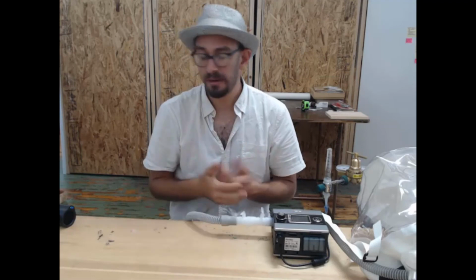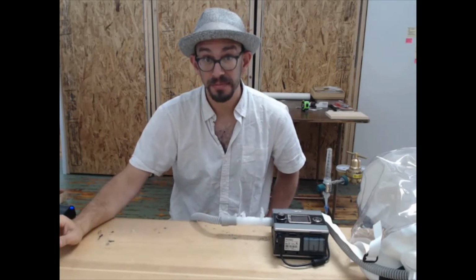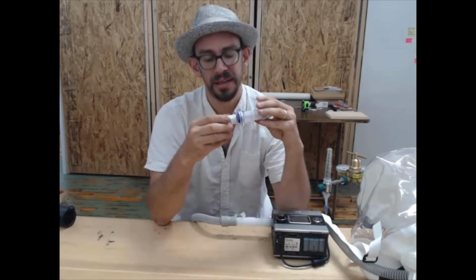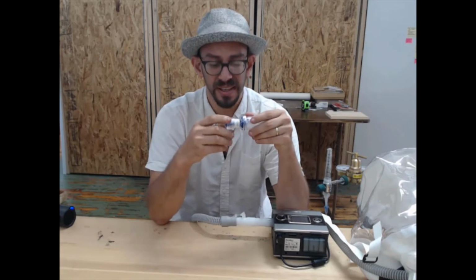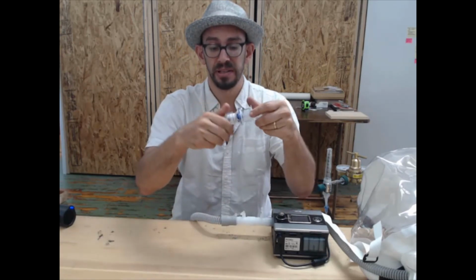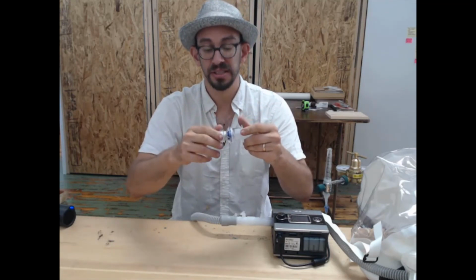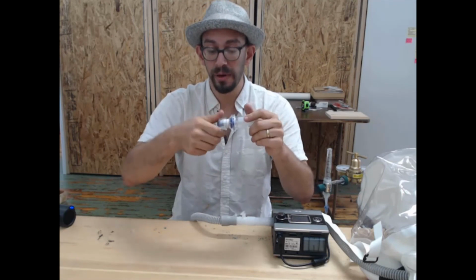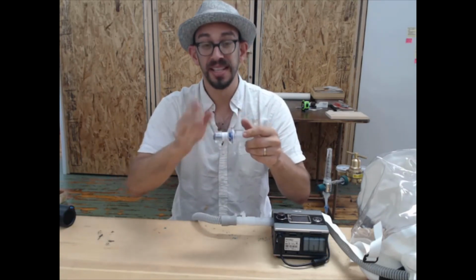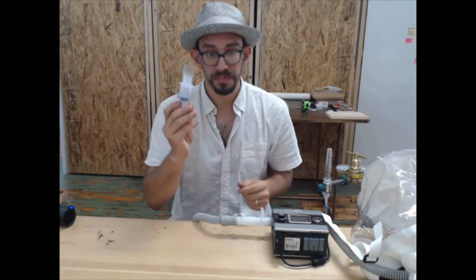Now, the very last thing I want to show is how to deliver treatment in the high pressure range. So in order to do that, take the PEEP valve, and you'll see the PEEP valve at the top has an adjustment where you can screw this top in to change the pressure the PEEP valve provides. Open it up all the way to the lowest pressure setting of 5 centimeters of water pressure, and once it's there, never change it again. It should always be wide open.